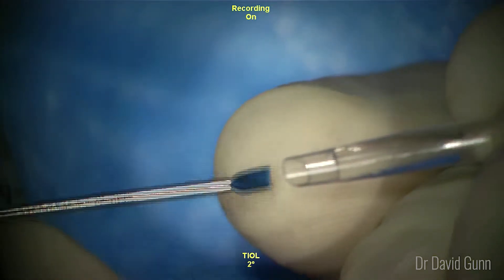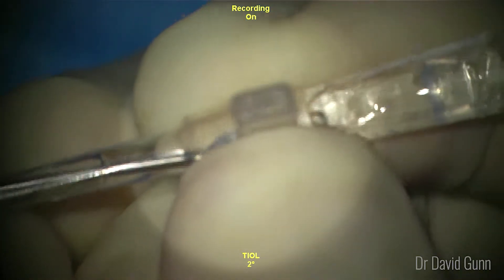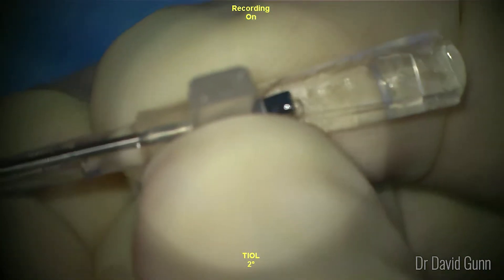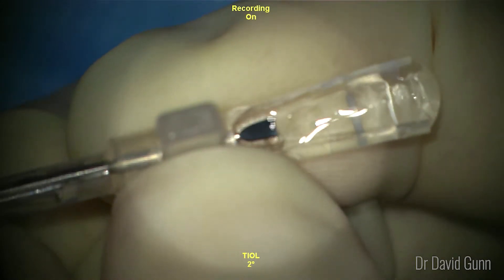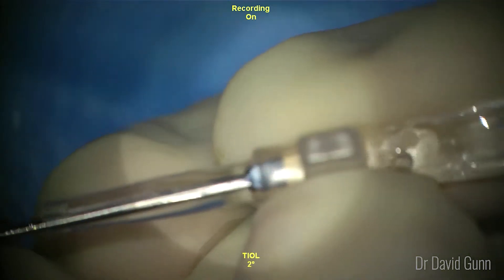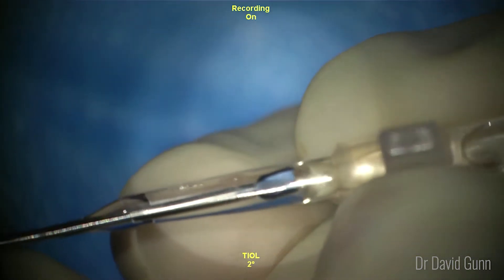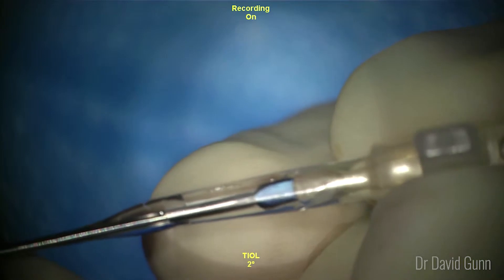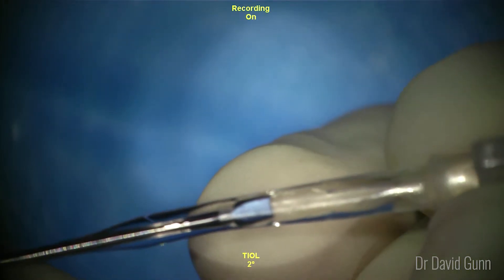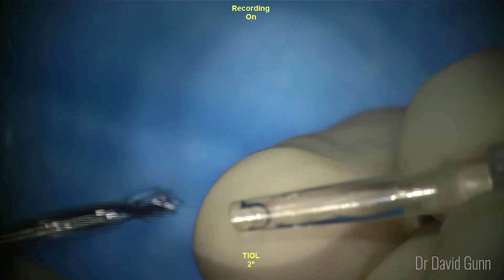These proprietary forceps are then passed into the cartridge to get a good full grip of the ICL. Holding my left hand steady, I pull my right hand gently away so that drags the ICL down fully into the cartridge. It's important to get a good full grab here, otherwise it is possible to rip a small amount of the soft lens at that point.